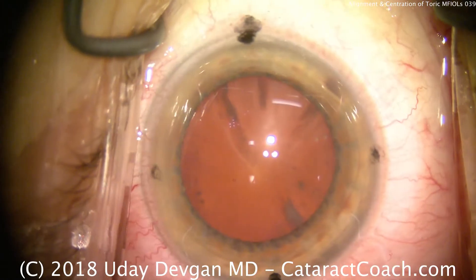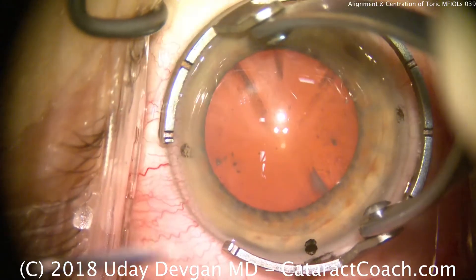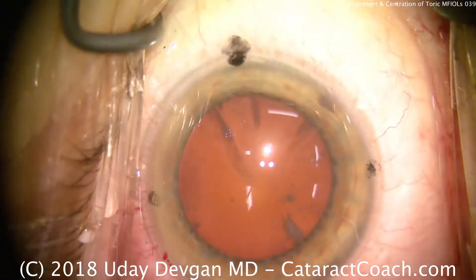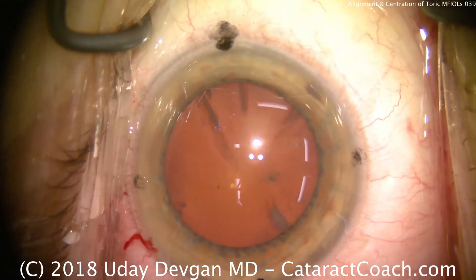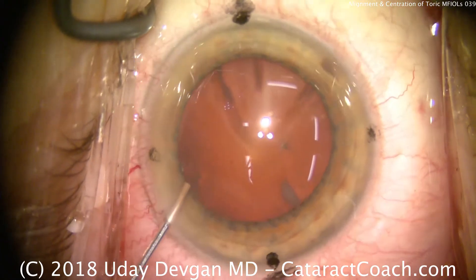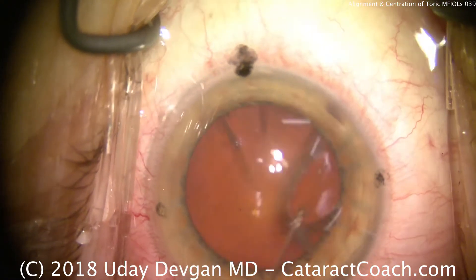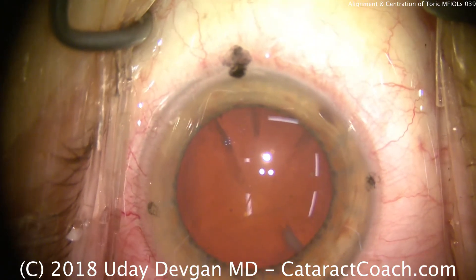Now that the marks have been made, we'll make our paracentesis. We're going to show you this video unedited — there's a lot to be learned from that. There's the paracentesis into the anterior chamber. We'll instill some preservative-free lidocaine for anesthesia, which squirts onto the cornea as well.